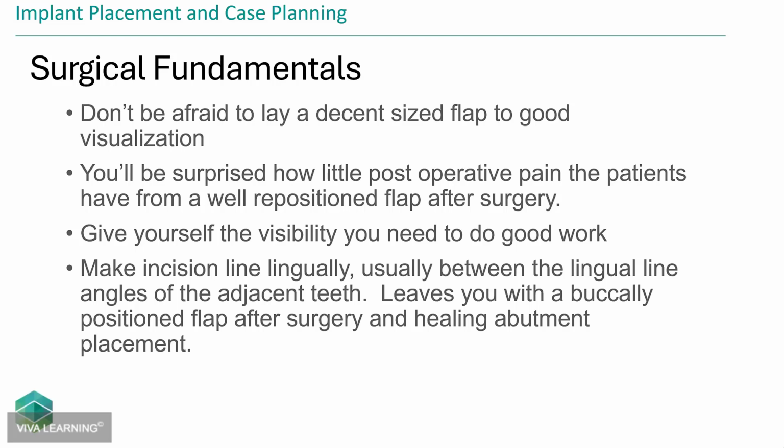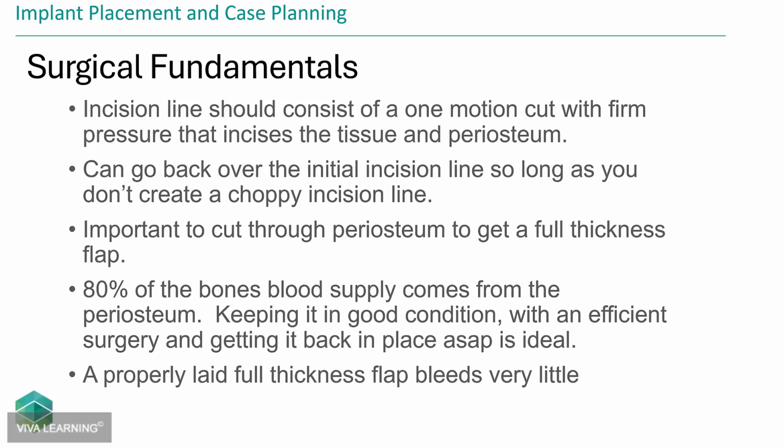So we're talking about surgical fundamentals. I know I'm getting a little bit long here, but the surgical fundamentals, if you're flapping, this is all I'll just say about this, make sure you learn how to lay a decent flap. I don't do as many flaps anymore. Any flapped cases, I'm largely doing guided now, which we'll talk about later.